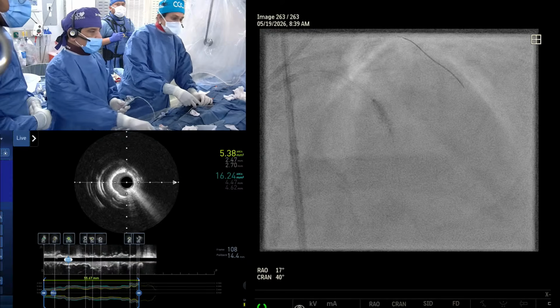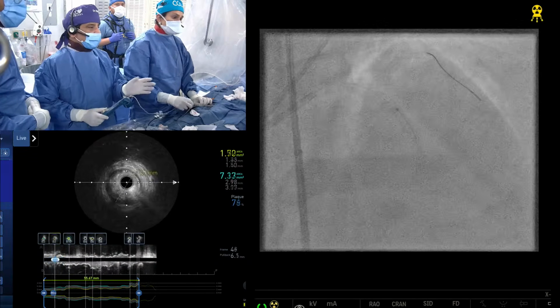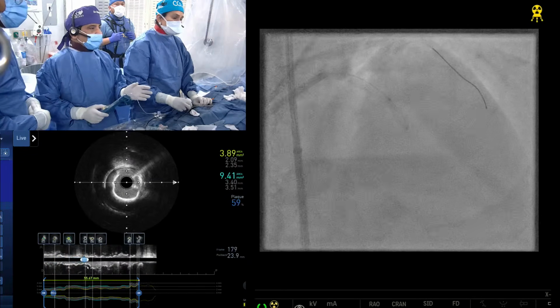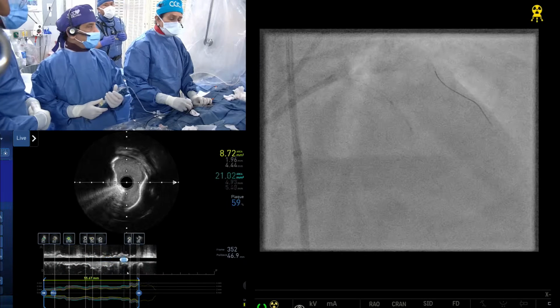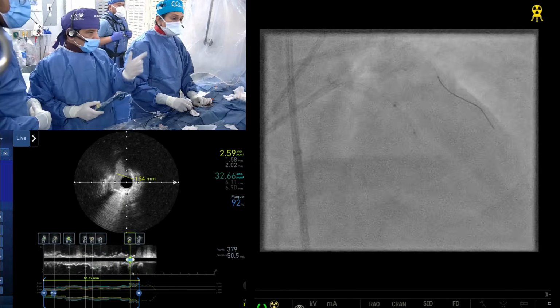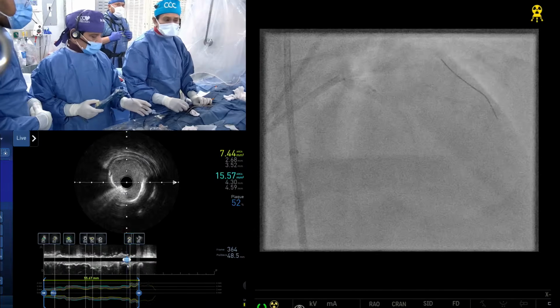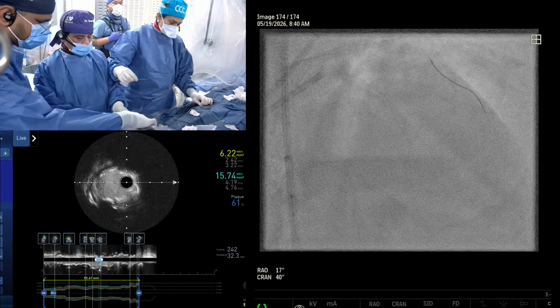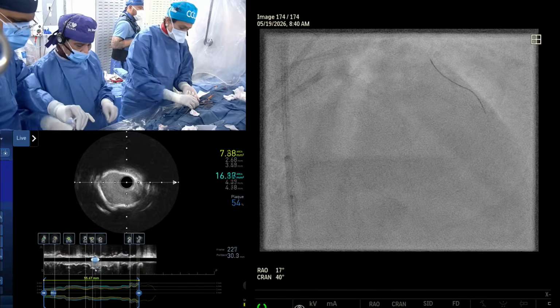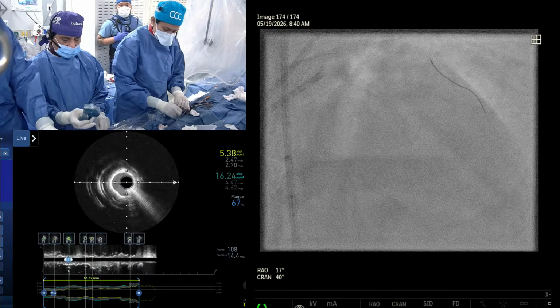Well, that gives the maximum pulses versus 3 or 4 pulses, where you think the balloon has expanded and you just limit there. So I'm actually coming out now. Just put it at the ostium once again. We've done it. Okay, you extracted a lot out of a single device. Okay, let's get the IVUS.